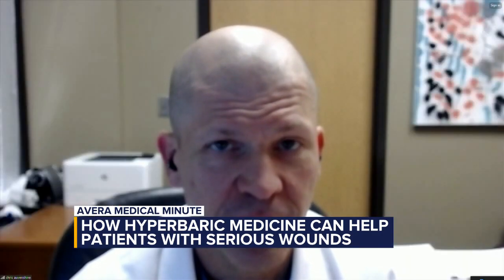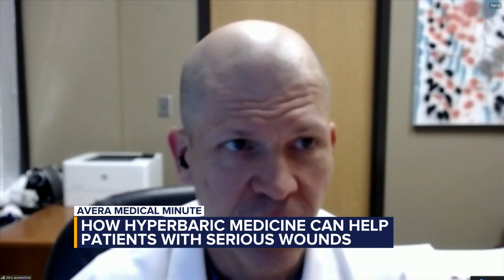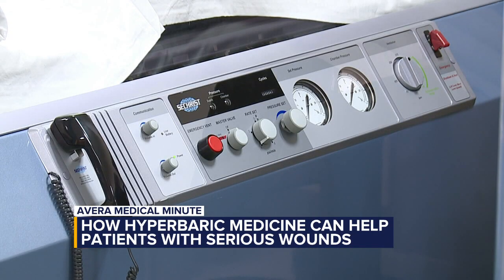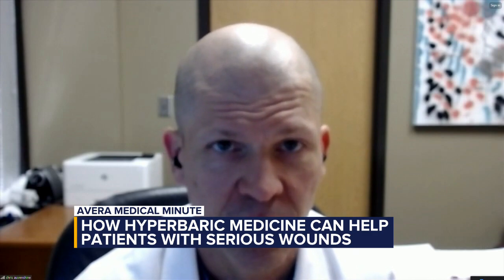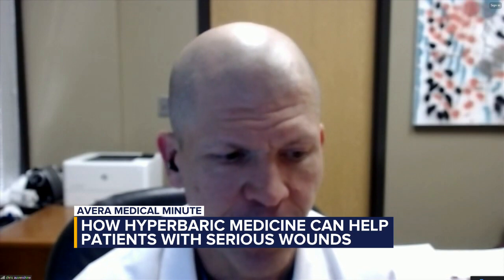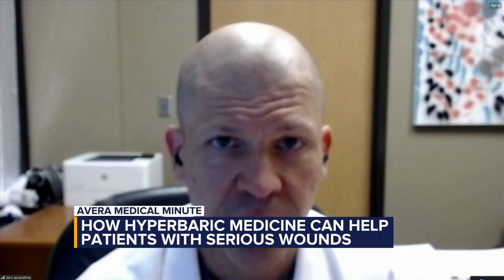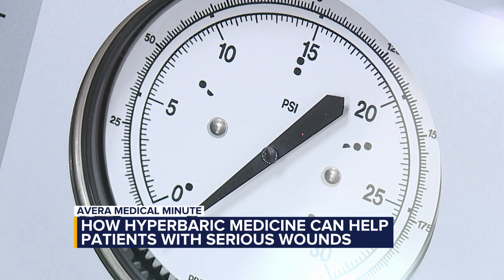Certainly. We do have patients that suffer from claustrophobia, and we can give them anti-anxiety medication to alleviate some of the anxiety that comes with that feeling. But the chamber itself is a large plexiglass tube. It has two steel caps on the end, one of which is a door that will be opened and closed to allow the patient to enter and exit. The chamber is see-through, and at the foot of the chamber is a television. And so many patients will elect to watch a movie or a television program of their choice.